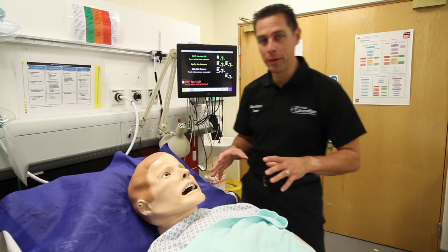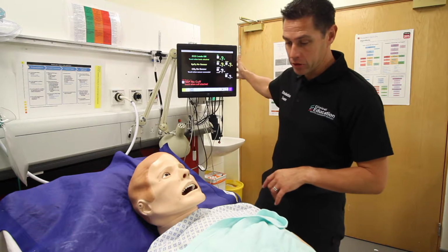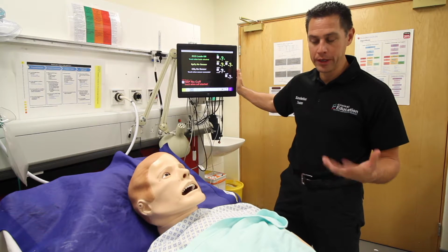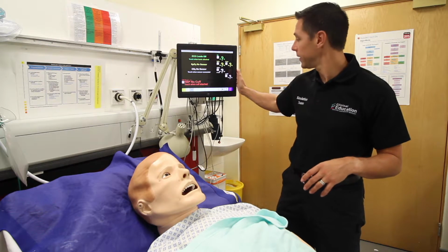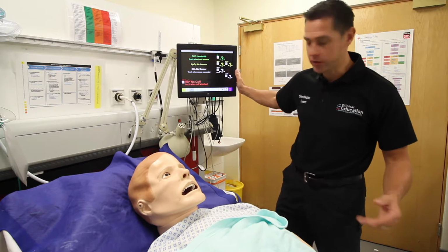So we're just going to have a little talk about the monitoring that you can use with SimMan and what we've got in the room here. So just on the screen, you've got a touchscreen monitor. It may not be what you're used to, but it'll be what will be in the sim room for your session. And so it's fairly straightforward to use. You just apply the monitoring like you would do normally.